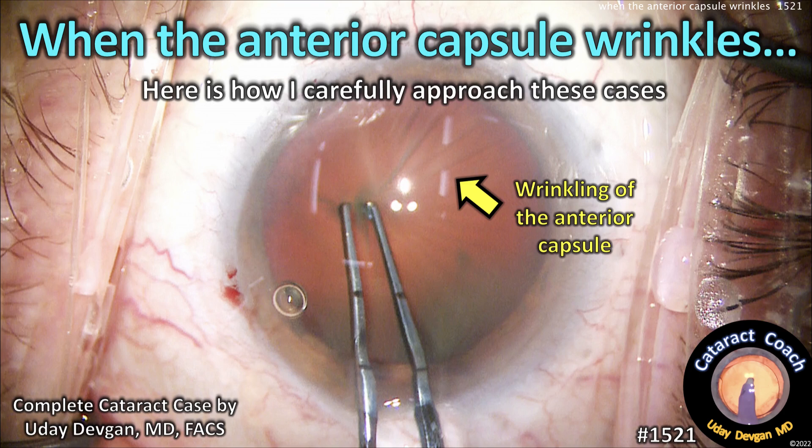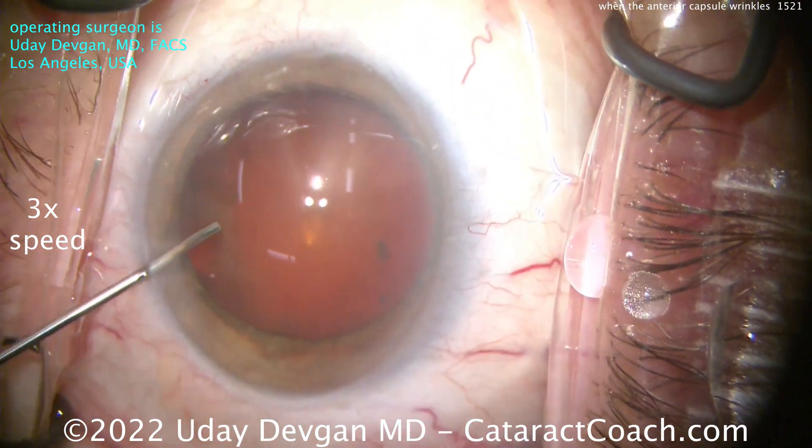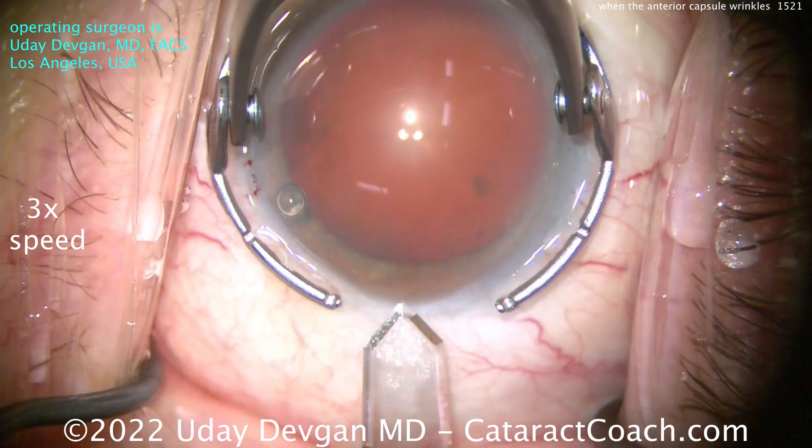When the anterior capsule wrinkles, here's how I carefully approach these cases. Wrinkling of the anterior capsule means zonular support is less than normal. I want that anterior capsule to be taut, really pulled, stretched tight — like the head of a drum.